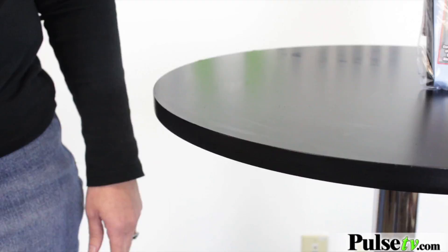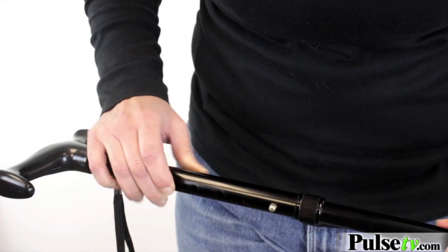When you get your cane, you're going to see this plastic piece — you really don't need it. It's just a protection for the tightening knob, and that actually allows you to extend your cane from 33 inches all the way to 37 inches.